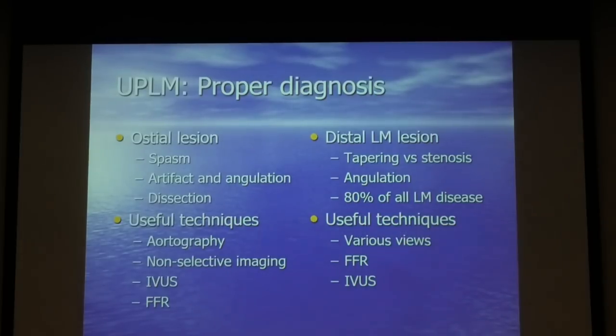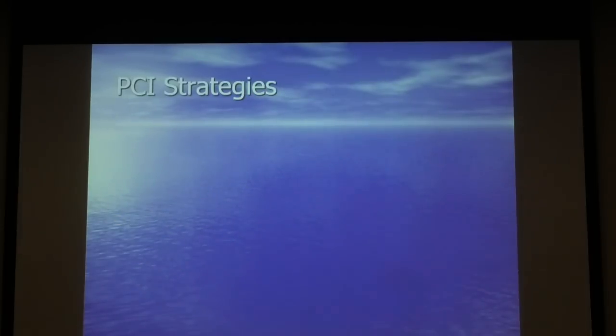Useful techniques, aortography is not usually helpful in these cases, but various views, special views, sometimes they are helpful. FFR and IVUS are sometimes a gold standard in the diagnosis. So keep in mind that not all distal left main tapering are disease. It could be just normal tapering of the vessel itself.